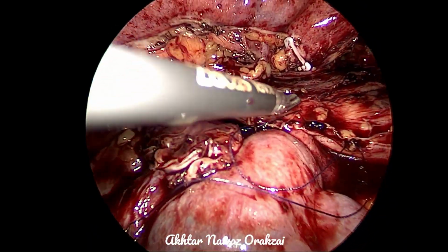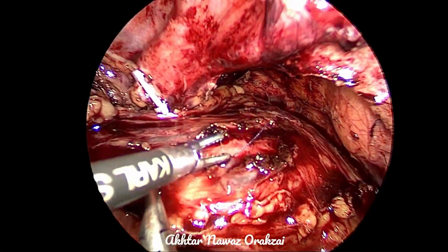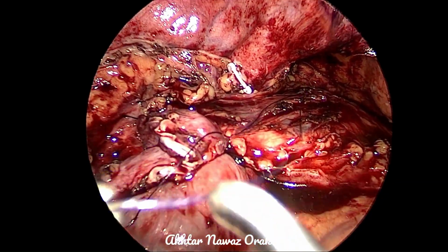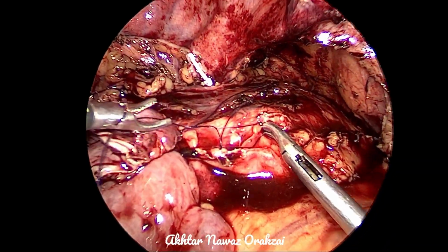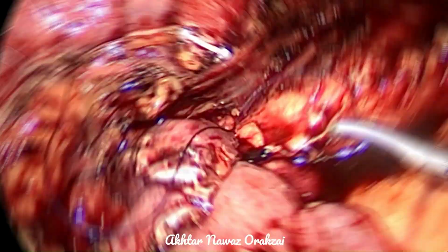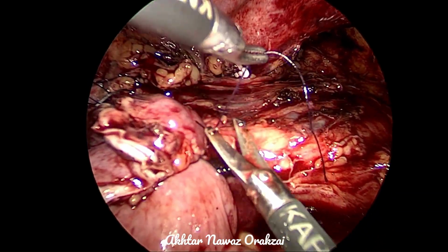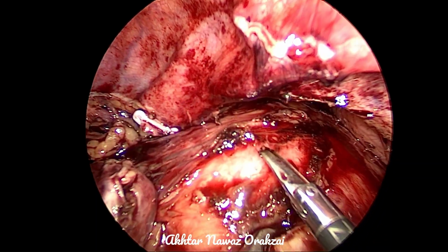However, the stitch is not necessary, but it does help in fixing the ureter. And care must be taken not to take the stitch in an area which will make the ureter stretch, so the ureter is placed at an easier location. Remember, I have taken this stitch with 4-0 Vicryl.